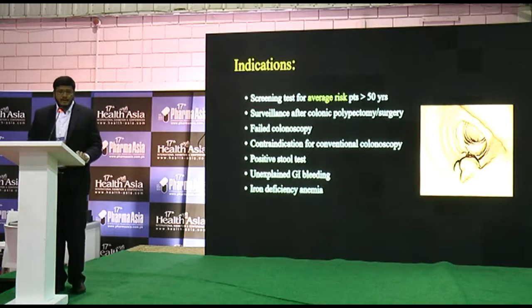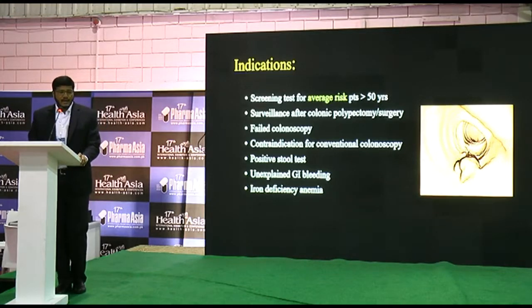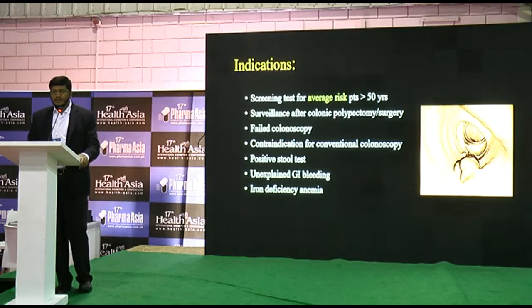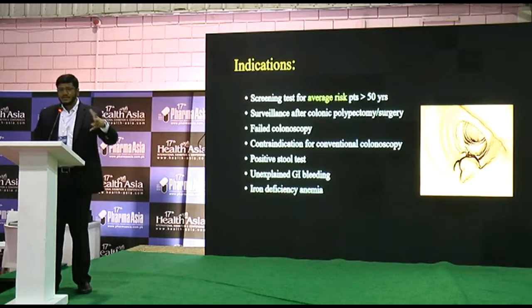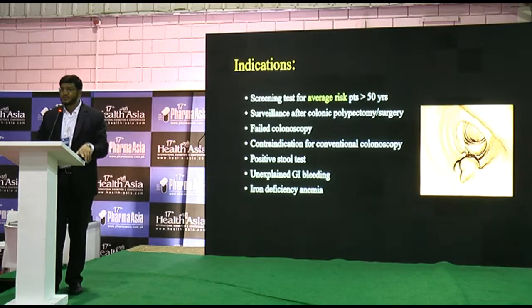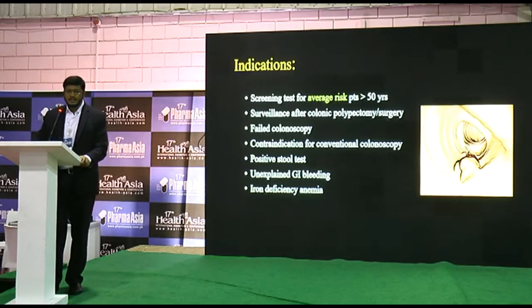In relation to the indications, it is the screening test for average risk patients, not high risk patients, of more than 50 years of age. The indications include surveillance after colonic polypectomy and surgery. In case of a failed colonoscopy, like a very large obstructing lesion where you cannot see beyond the lesion, it works in that situation. It is also used when conventional colonoscopy is contraindicated, for example when the patient has sedation issues or another condition in which optical colonoscopy is contraindicated. There are some other indications: positive stool test, unexplained GI bleeding, and iron deficiency anemia.